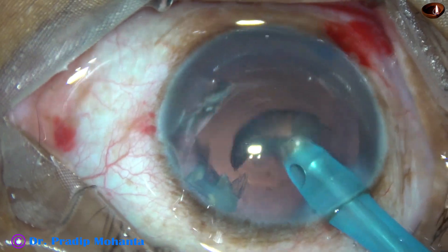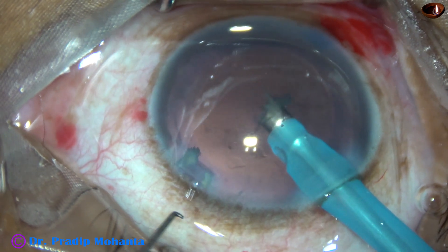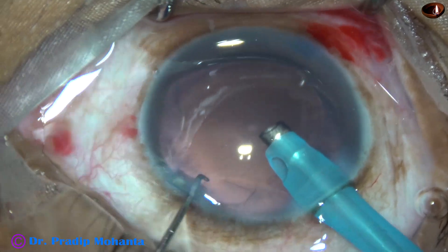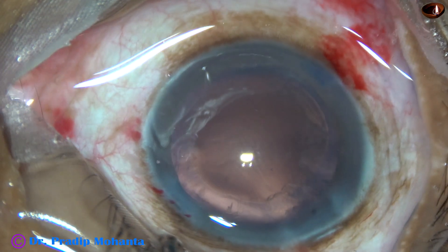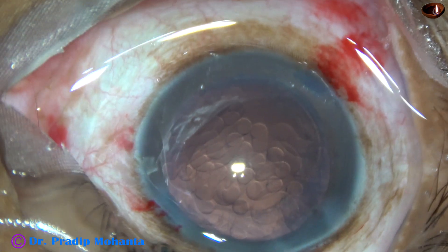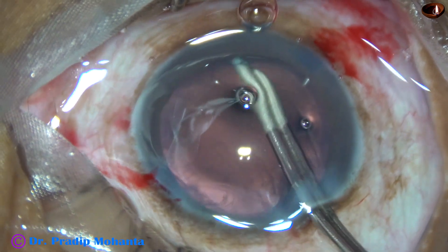Now once the nucleus is managed, we have to remove the epinucleus — it has been done. Now this is a small bit of nucleus; it comes out through the side port. And we have managed the nucleus very well underwater. Our underwater phaco has been a success.